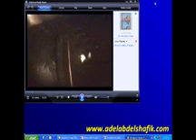If you get the appearance of the peripheral part of the angle with the slit lamp, if you go to the periphery of the angle and make a section and compare the thickness of the cornea and the depth of the anterior chamber in the most peripheral part. Here in this video, if you go very peripheral, the distance is quite short compared to the thickness of the cornea. So most probably you are dealing with a narrow angle.